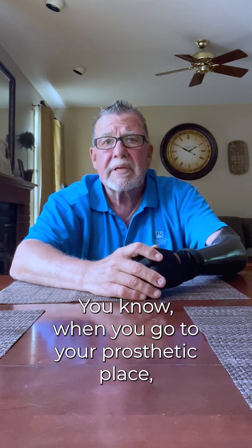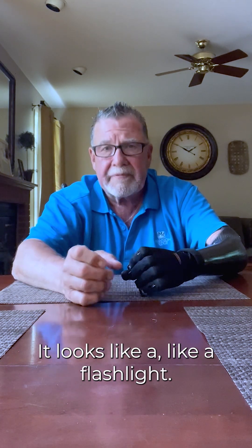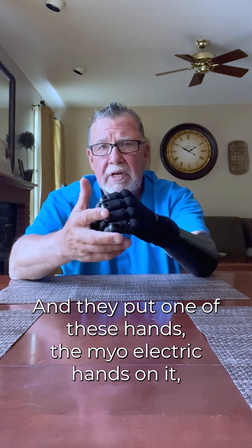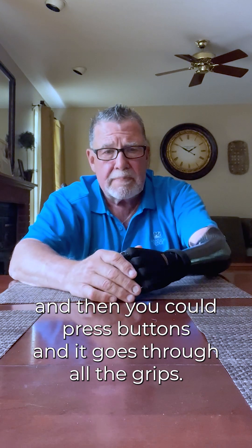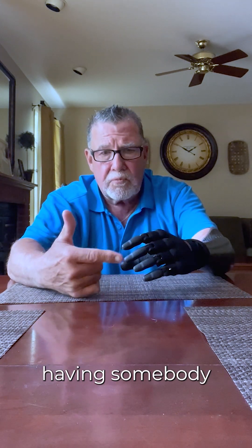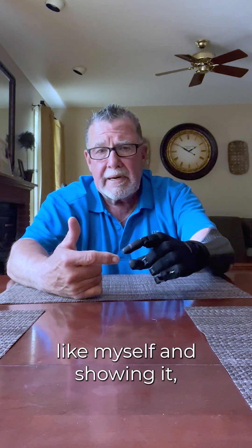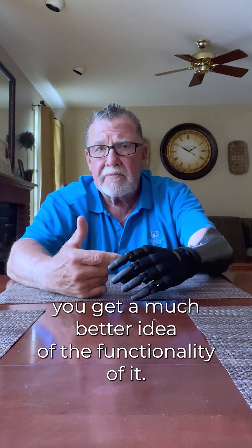When you go to your prosthetic place, they have a thing called a torch. It looks like a flashlight, and they put one of these myoelectric hands on it, and then they can press buttons and it goes through all the grips. But I think having somebody doing it on a practical basis, like myself, and showing it, you get a much better idea of the functionality of it.